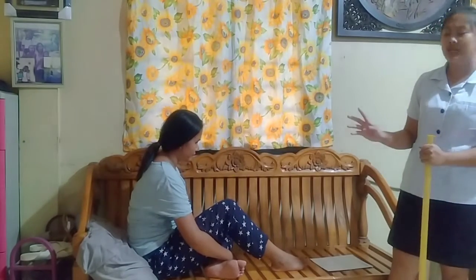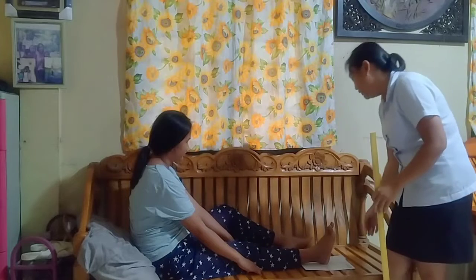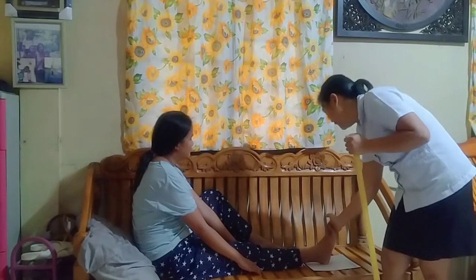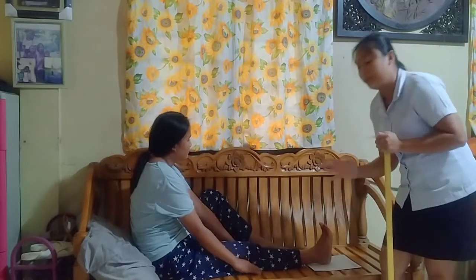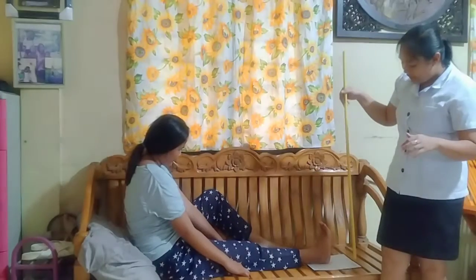Okay. Next projection will be the AP projection of the ankle. Now, instruct the patient to be in supine or in seated position. Extend her limb and foot is in contact with the IR. Now, make sure that the foot is in dorsiflexion, so the foot and the IR remain perpendicular, meeting 90 degrees.